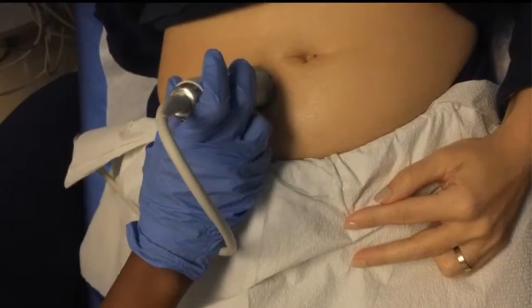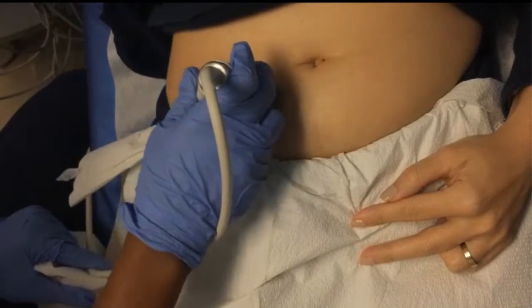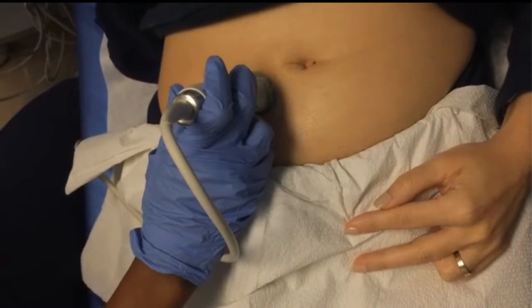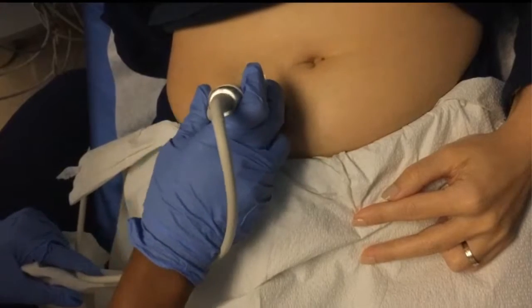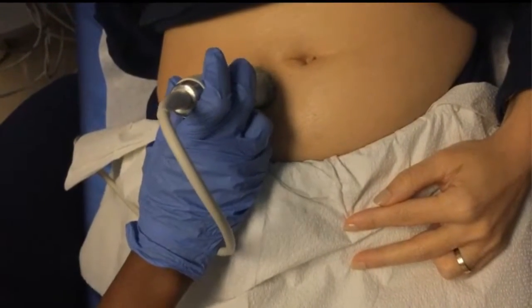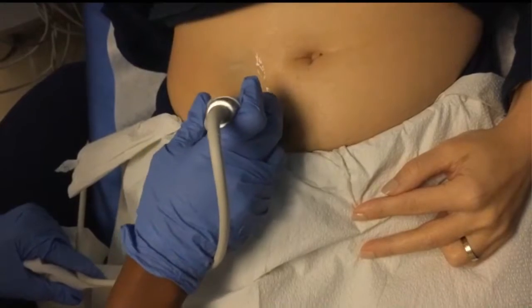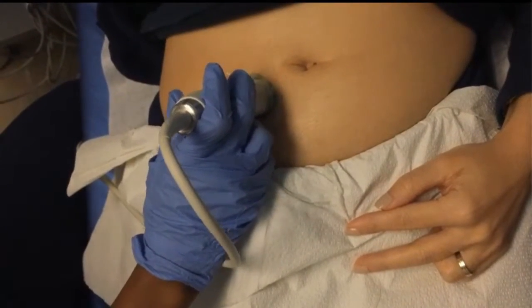As you can see in this video, the sonographer is using compressions with the transducer to help displace small bowel loops out of the way. And the displacement should allow the visualization of the iliac vessels in the right iliac fossa as well as the psoas muscle. Compression will also help determine if appendicitis is present or not.